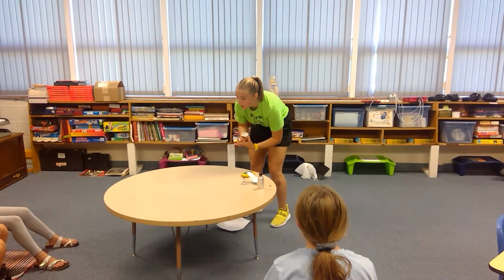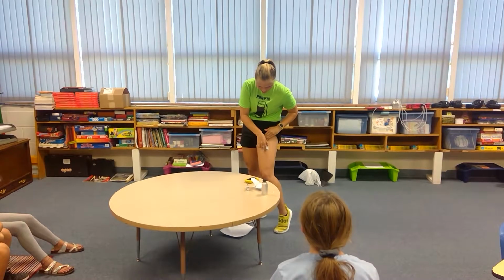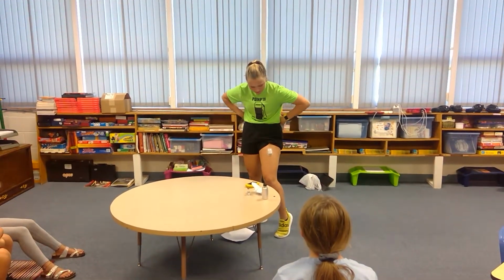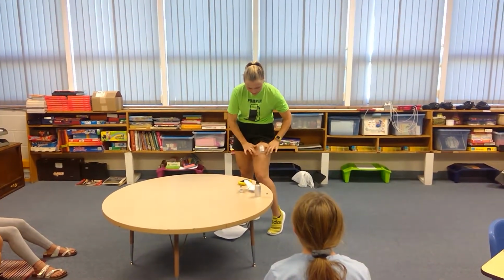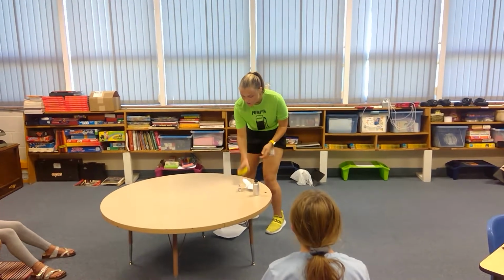And then our next part is we're going to pinch. So after we place on the pod, it can be put on the arms, the legs, my stomach, my back, my hips, anywhere. Then we're going to make sure it's nice and flat and sticking to the skin. As soon as it's stuck, we are ready.